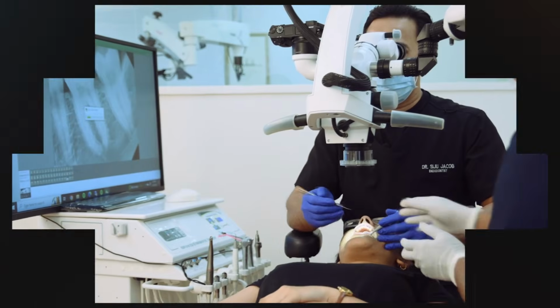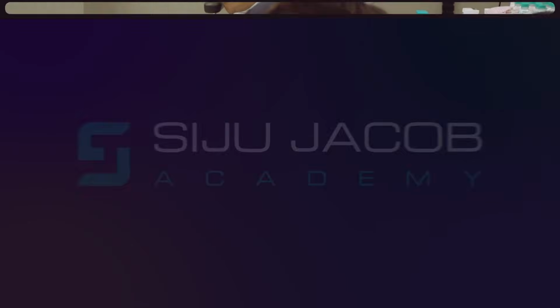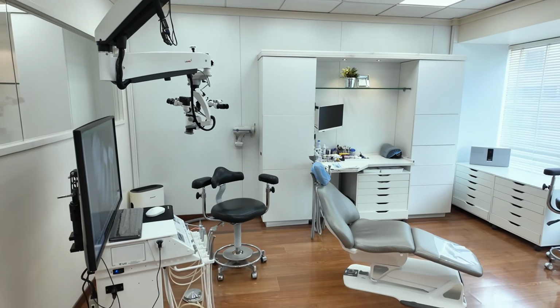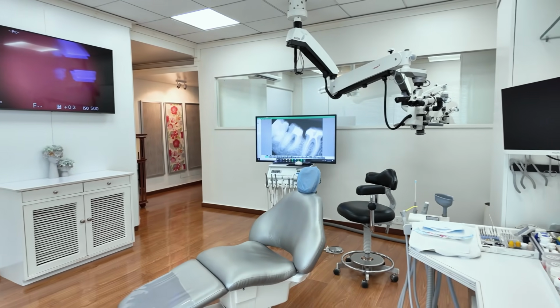So let me just give you a guided tour into one of our operatories. You will notice, and many of you have asked me in many of the videos, that our operatories are a bit different from what you see conventionally in most clinical practices. And why is it different from most clinical practices?